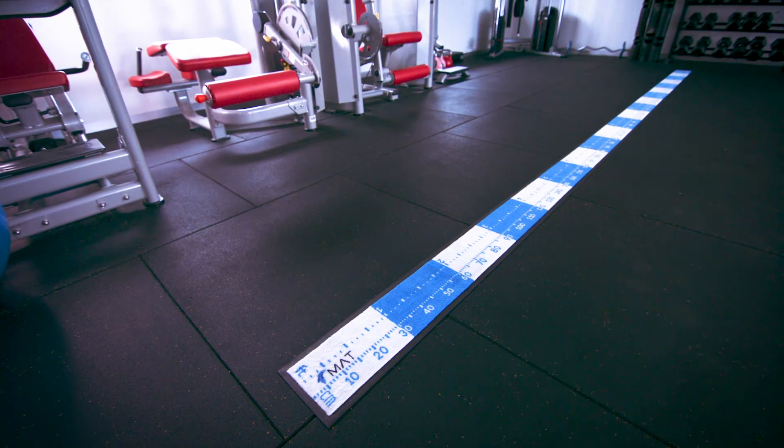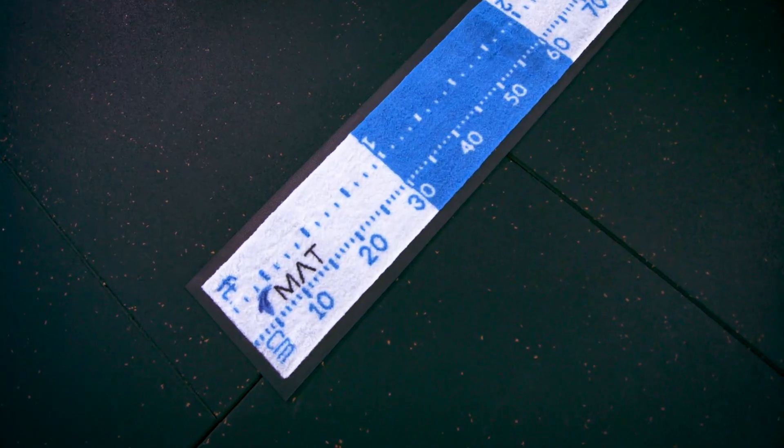The HOTMAT not only provides a great assessment and training environment in your clinic or gym, you can also take it down to your local sports club so you can assess your athletes anywhere in the world.